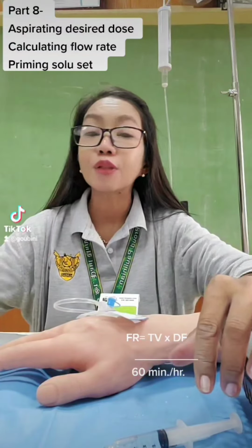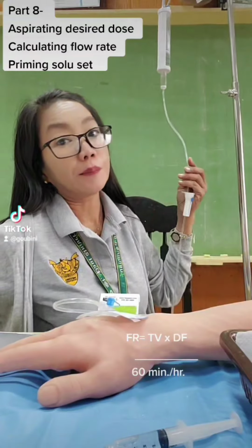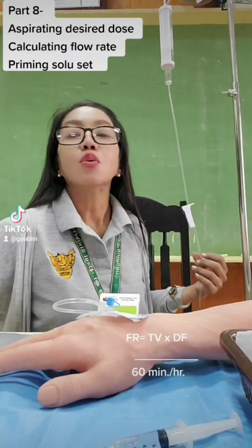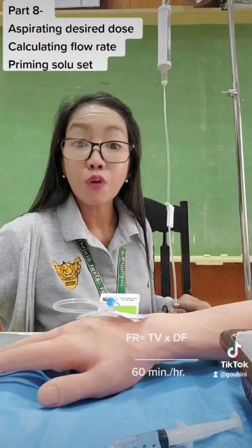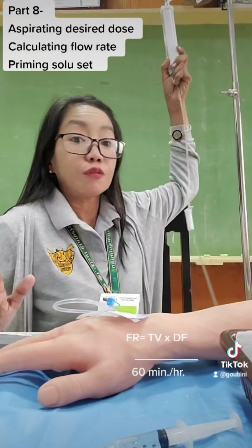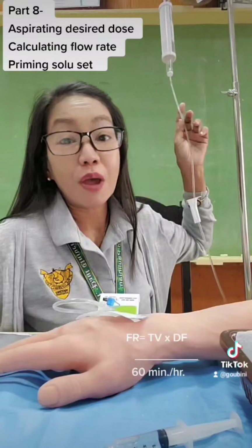Now we will calculate your flow rate, or the drops per minute, how much you will regulate this intravenous line. So your flow rate formula is total volume, that will be the cc per hour. That's the amount of solution inside your soluset. So this is 50 cc, to run for 30 minutes. 30 minutes is about 0.5 hours.